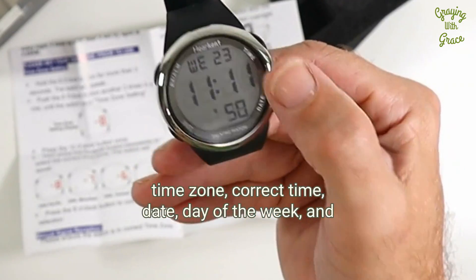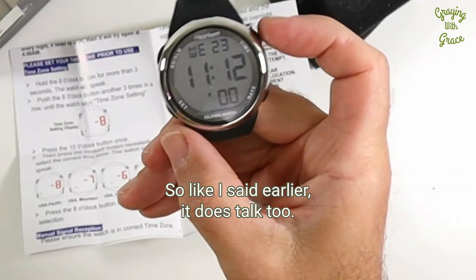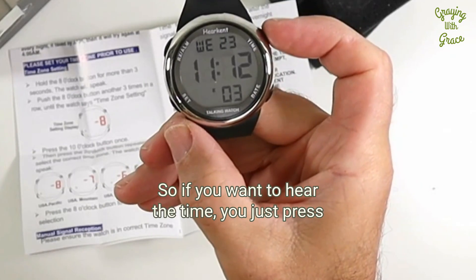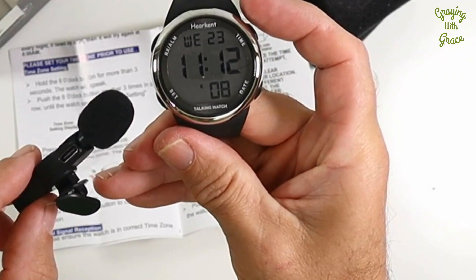The display also shows the correct time, date, day of the week, and the seconds. It does talk too — if you want to hear the time, you just press this button right here. The watch says: 'The time is 11:12 a.m.' So that reads out loud the current time for you.